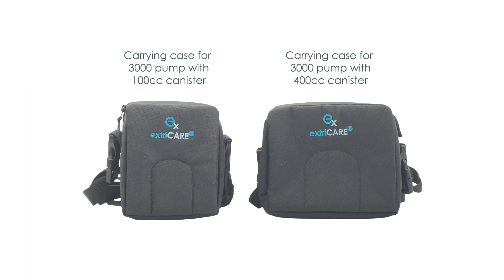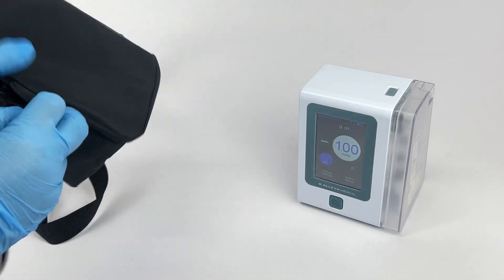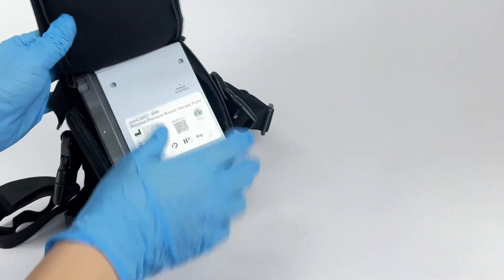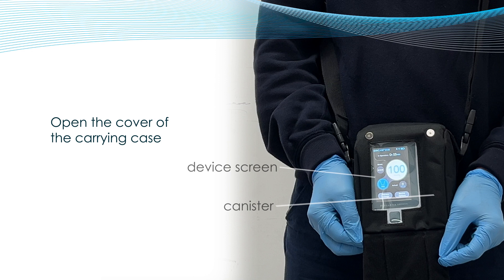Carrying Case. The ExtraCare 3000 has two carrying cases — one to be used with the smaller 100 cubic centimeter canister, and a larger one for the 400 cubic centimeter canister. They are sold separately. Putting the unit into a carrying case is very simple. Open the zipper at the back of the carrying case and place the unit in, screen first, so the back label is facing you. Then close the zipper. There are multiple windows on the carrying case. On the left side, you will find the power button and the adapter port. On the right side, there is a cutout for the inlet tubing. Opening the front cover, you will see the touchscreen of the unit on the left and the canister level on the right. The ExtraCare 3000 touchscreen is designed to work through the window of this carrying case.